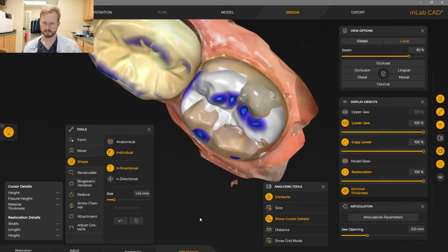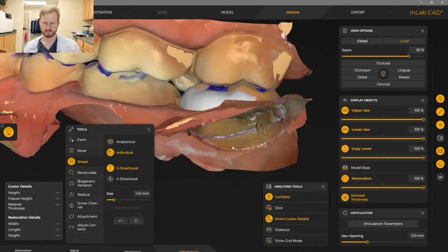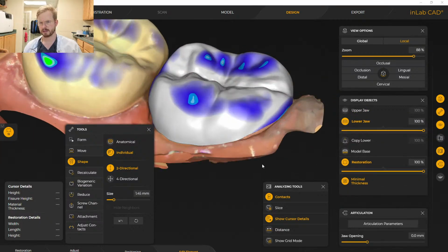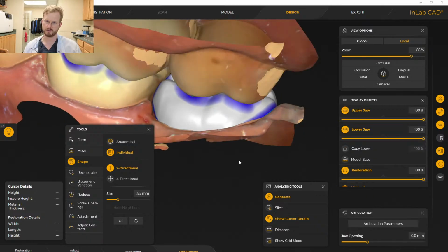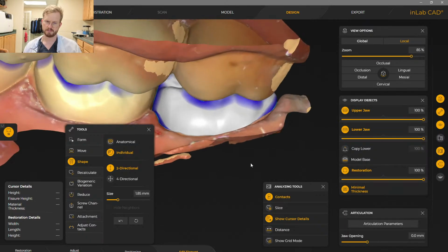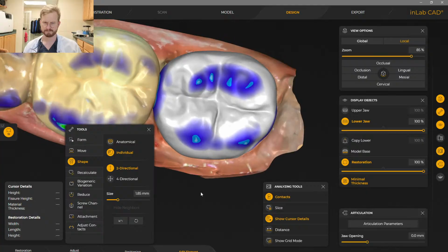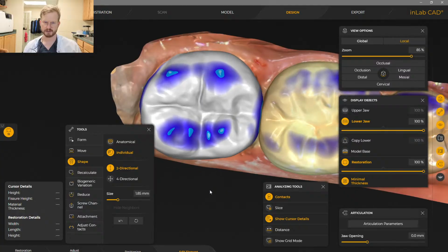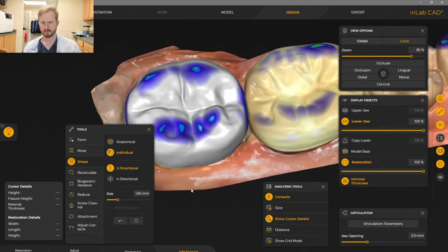So pre-op, oh, it's fine. I'm going to bring this distal buccal cusp up some, so that we've got even a little more encouragement for that tooth to stay in its position or keep that contact nice and tight. Okay. Fissure height's good. Occlusion looks great. Contour of the tooth looks okay. I have no problem with that contour.